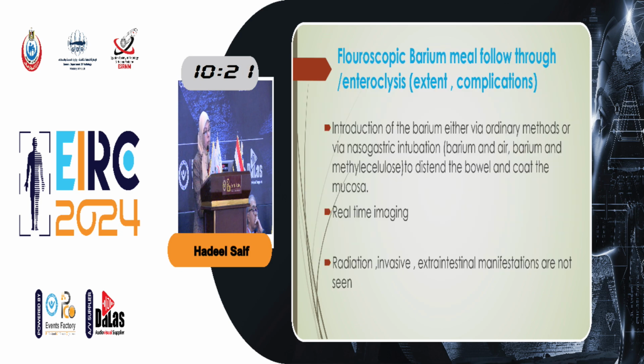Now we come to the fluoroscopic barium meal follow-through, whose importance is going to be very much declined in the next era because of the development of the more recent MR enterography, which saves the radiation exposure for the patients and does not depend upon the proper filling of the bowel.